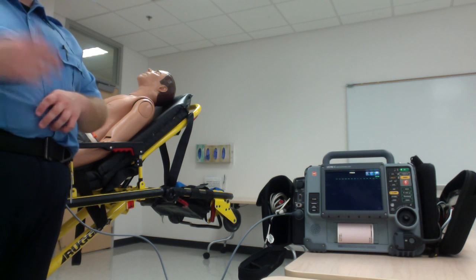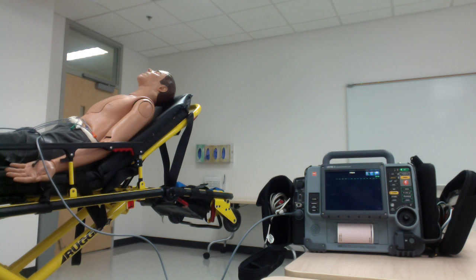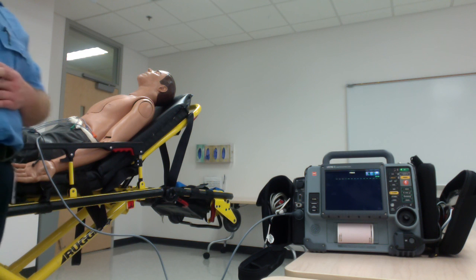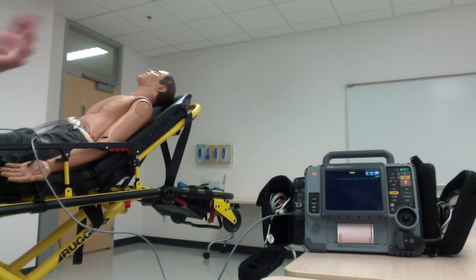EMT basic and intermediate can both acquire it. They can place leads and acquire the 12 lead, but they cannot legally interpret it. I just want to make sure that's clear, so you don't put in your narrative, patient's having this, this, and this per me. Patient's having this per the paramedic, I'm sure, would be okay. But you can go off what your agency says. If your agency says yes, I can do this, or no, I can't, then that's what you have to do.